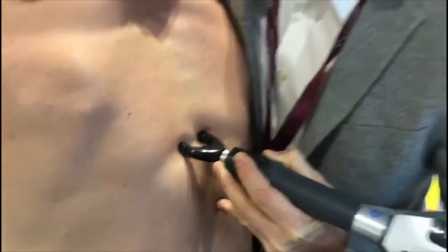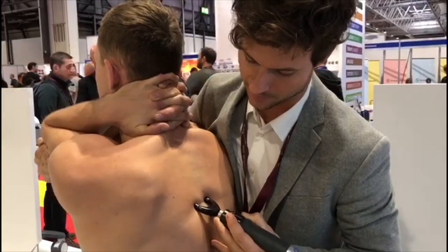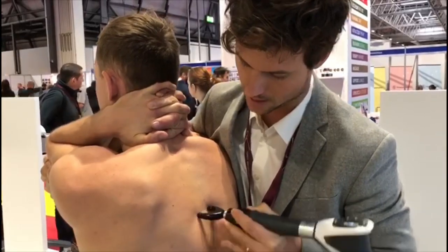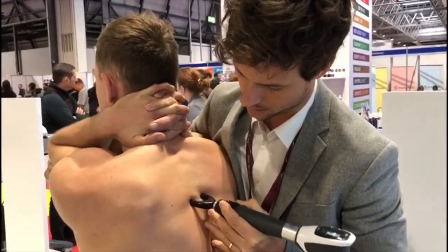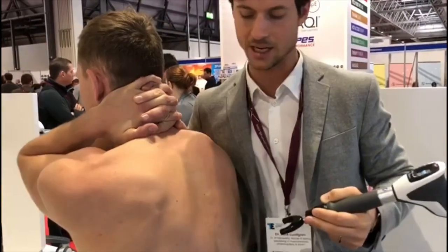So this is in an extension position. You have to try to get the right angle, which is approximately 60 degrees to the joint, to get the joint moving. Like that, and then we'll try. There is the joint as well. Still comfortable? Yeah. Good. All right, so we'll change to a flexed position.